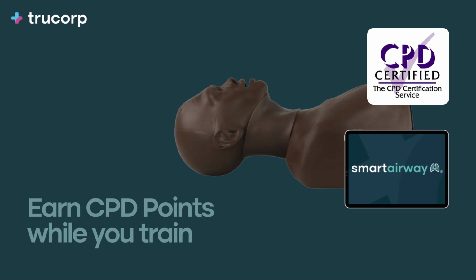Earn CPD points while mastering airway management. Realistic, hands-on training for professionals.